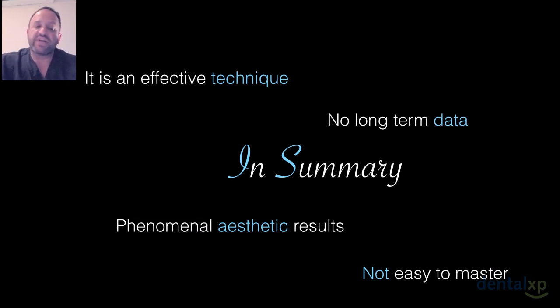But essentially, the kind of aesthetic results that we're starting to achieve with this, with thin implants, with multiple implants, and I've got some new stuff of mixing this with root submergence and stuff like that, where we're really getting unbelievable stuff. But I warn you, it is not easy to master, and for those who are starting out with immediate implants, this is an advanced technique, and I would strongly urge you to go through the immediate protocol first and become au fait doing immediate implants before you start taking on the socket shield technique.